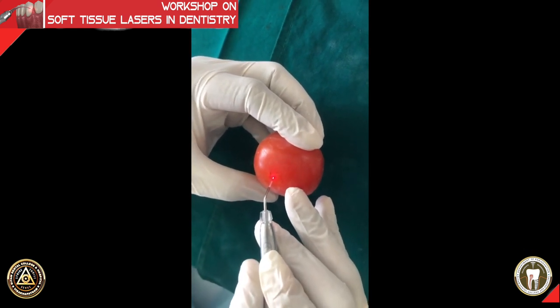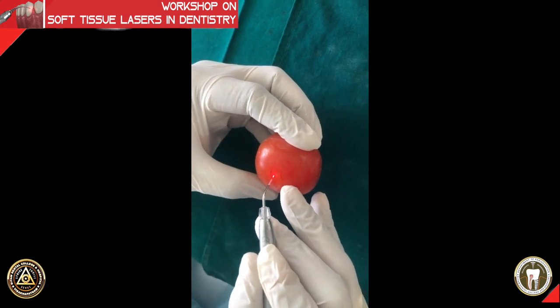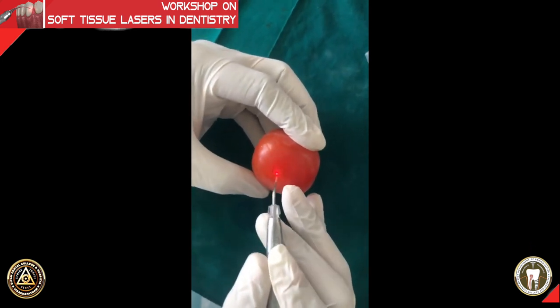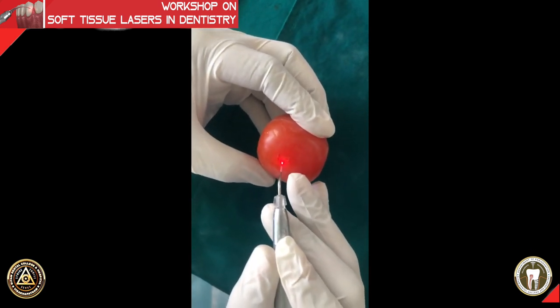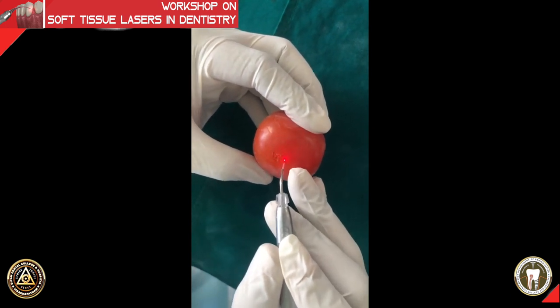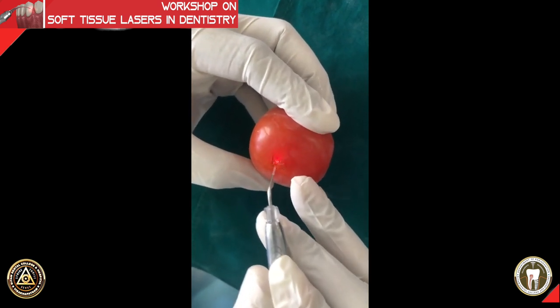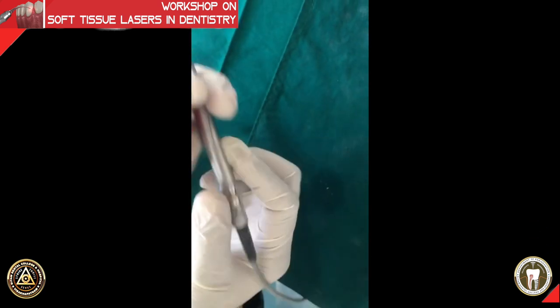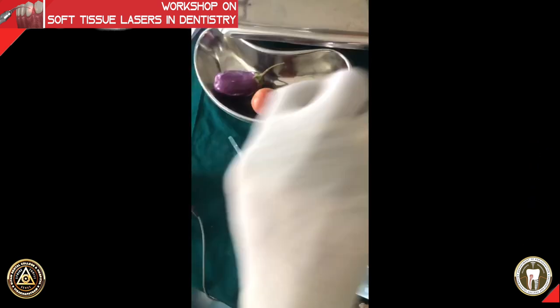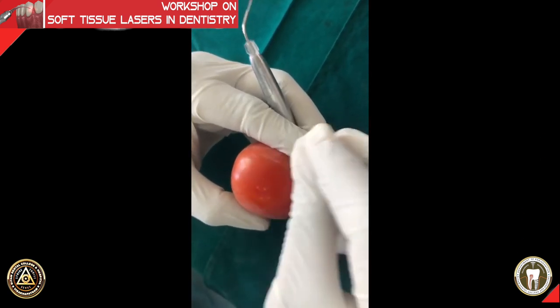Both methods have their own pros and cons. The pinpoint hole method is not advisable for a thin biotype. If you have thick gingiva you can use that method, but for thinner gingiva just scrape on the surface. Don't try to remove the epithelium with your laser tip — use a wet gauze and wipe with firm pressure; the epithelium will just peel off.